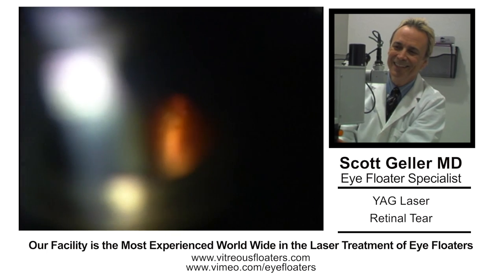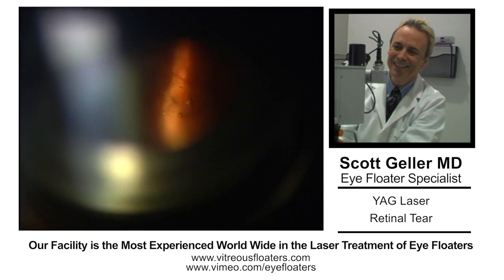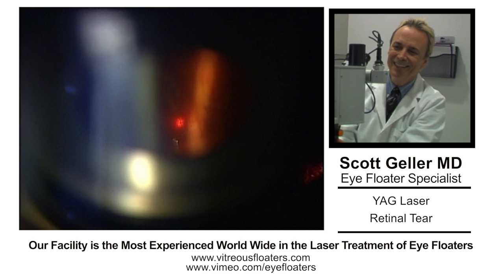This video is abbreviated because it took a little longer than two minutes, but it was very satisfying. This was the second patient I've ever done this on, and I'll try to post another video for you.